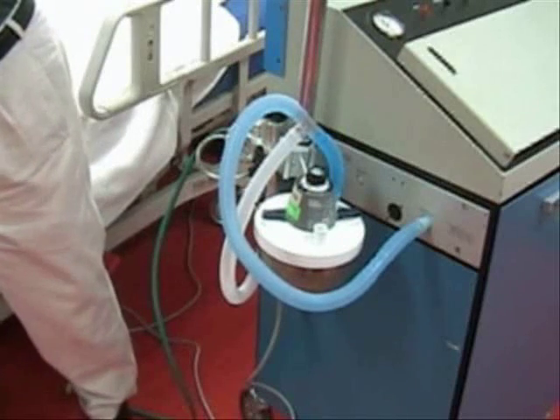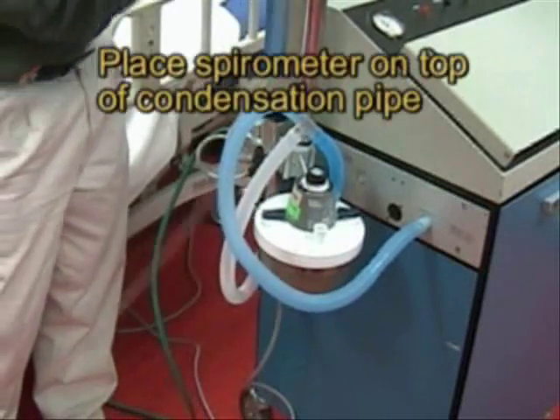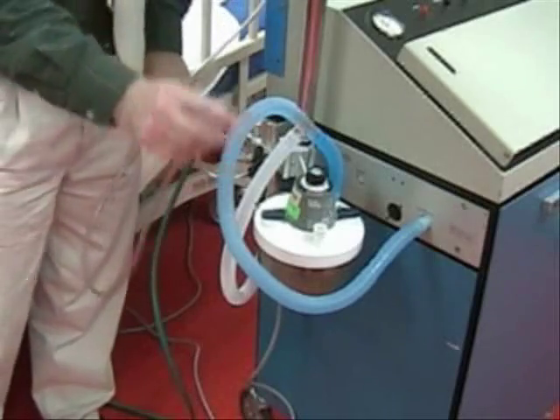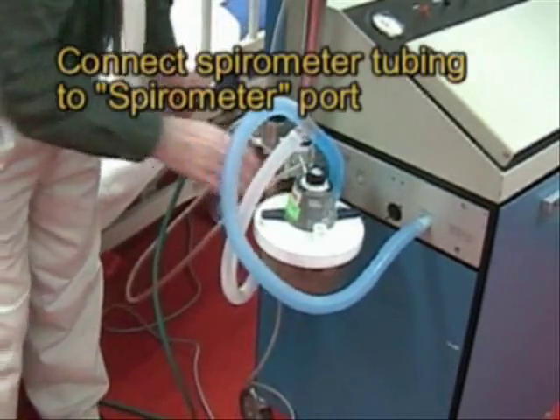Now we can place the spirometer on top of the cooling tower, and the end of the tubing goes to this black connection called the spirometer port.